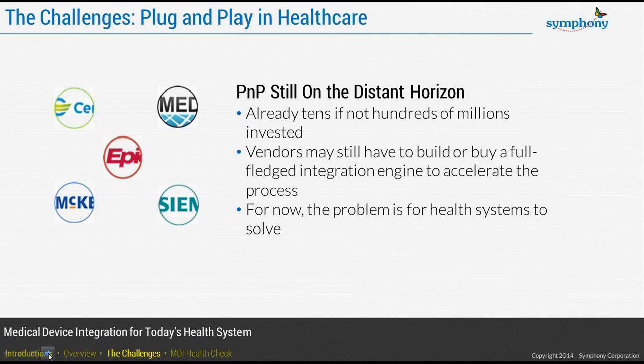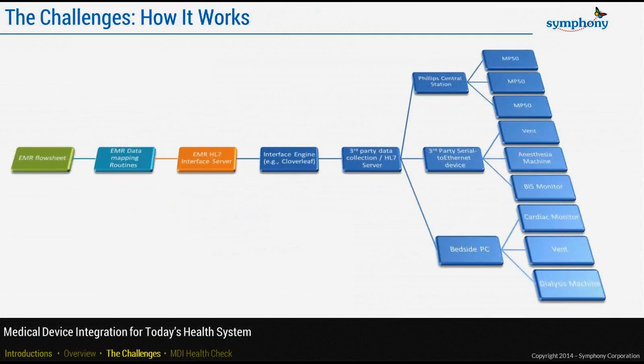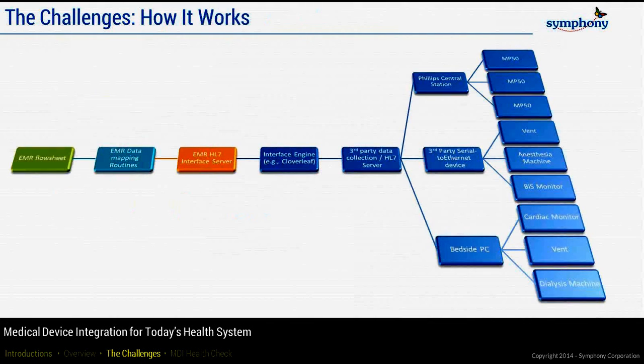There are standards that are being accepted as the basis to build out the framework we would need to develop a plug-and-play solution. But for now, the problem is for healthcare systems to actually get this all worked out for themselves. So basically, plug-and-play is out there. It's just not here yet.